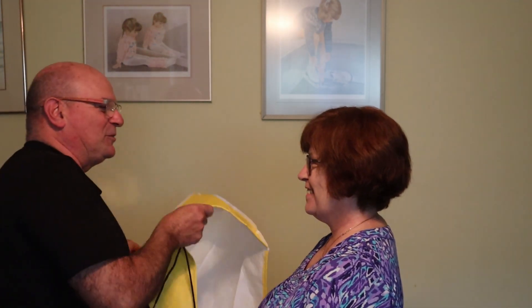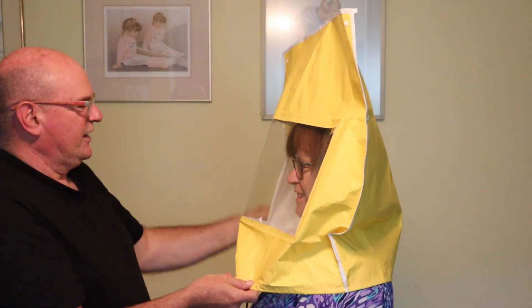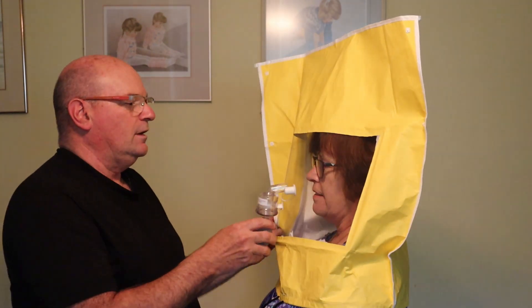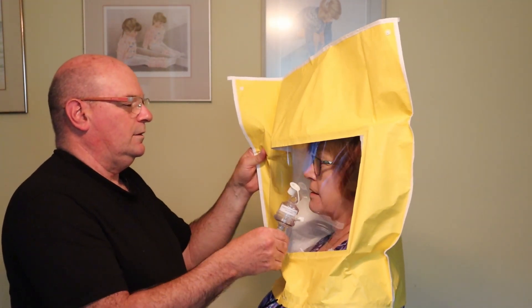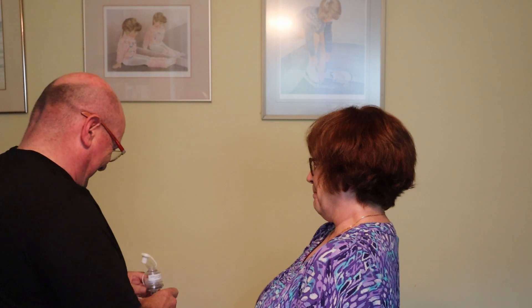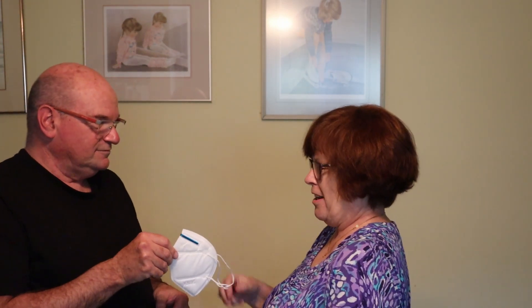This solution I'm using is called Bitrex — it's a bitter solution. Just remember, I love you. And when this is over, hopefully it will still be the same. So I'm going to test you for sensitivity. Keep your mouth open just a little bit and let me know the minute you can taste it. Oh my gosh. Okay, we're good. I'm going to pay dearly for this, I know it. It tastes like a rubbing, rotten, elastic thingy sock. Did I mention I love doing fit tests?